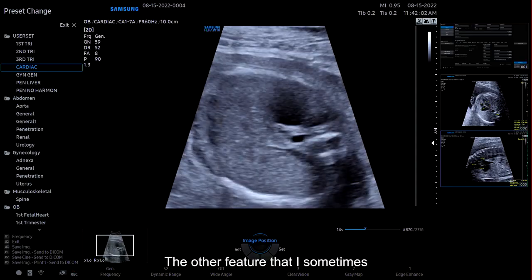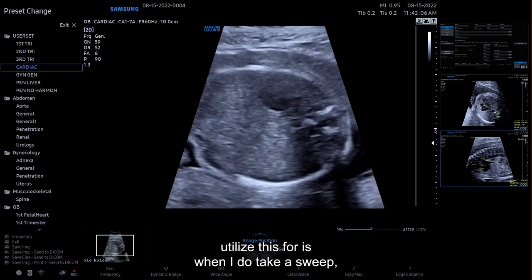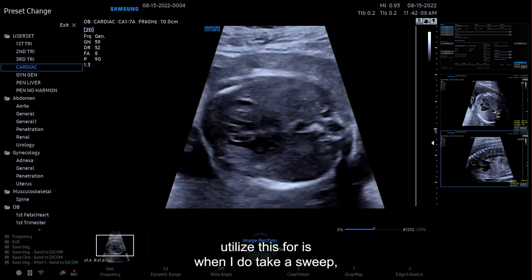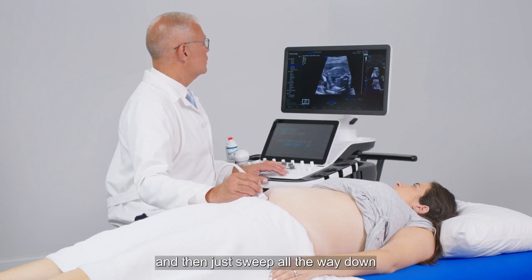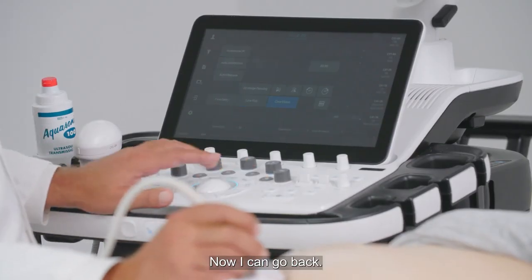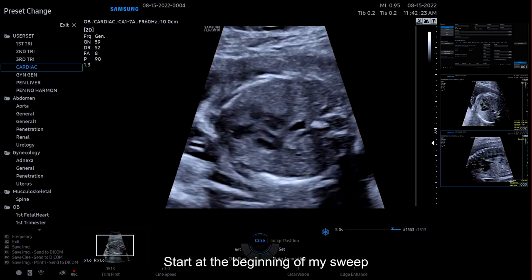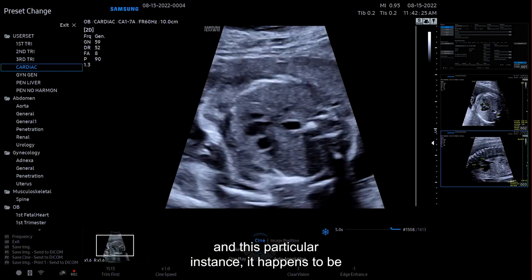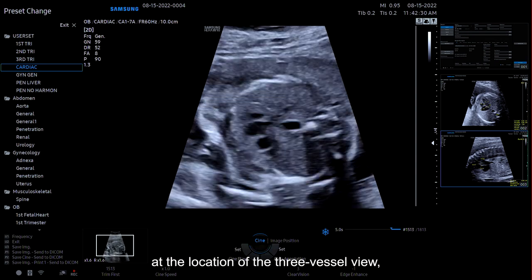The other feature that I sometimes utilize this for is when I do take a sweep, a cardiac sweep, where we start off at the top and then just sweep all the way down as we're getting those images all the way down to the apex of the heart. Now I can go back and start at the beginning of my sweep. In this particular instance, it happens to be at the location of the 3-vessel view.